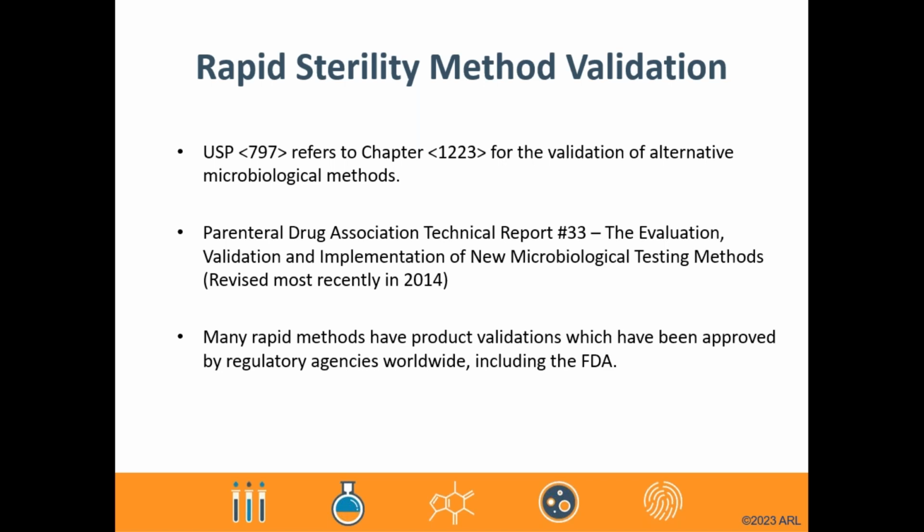Historically, the task of implementing rapid sterility testing was considered very difficult and actually a barrier to entry for QC microbiology labs not familiar with those alternative rapid methods. However, regulatory agencies have since responded and have published additional guidance, as well as documentation to assist in that implementation.